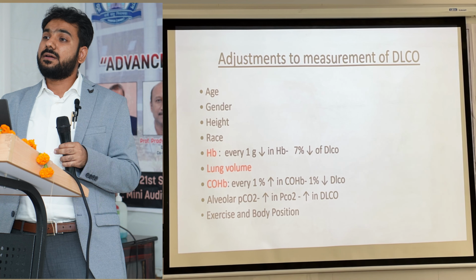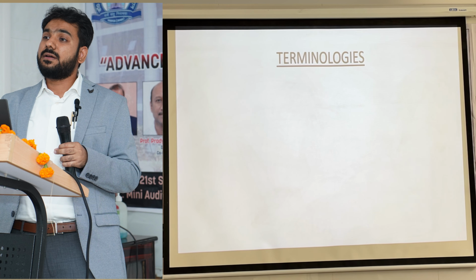And obviously exercise and body position, if the patient is exercising, more amount of blood is reaching the capillaries, it will affect the values of DLCO. And body position like supine and prone, but we obviously do the test when the patient is sitting, so that is standardized, so it won't affect. Otherwise body position obviously affecting the VQ of the test, and it will ultimately affect.